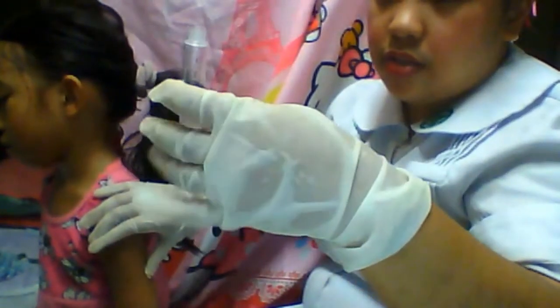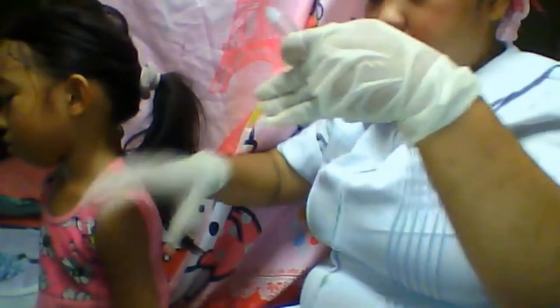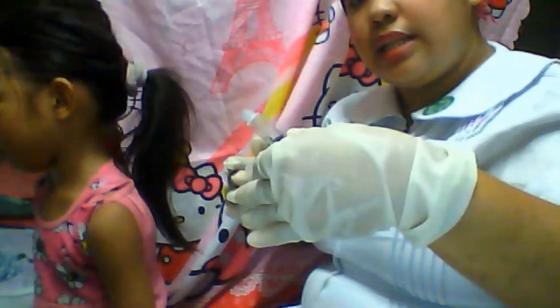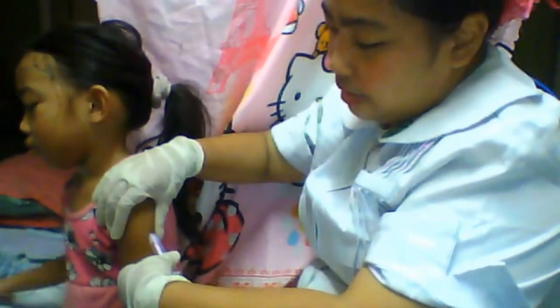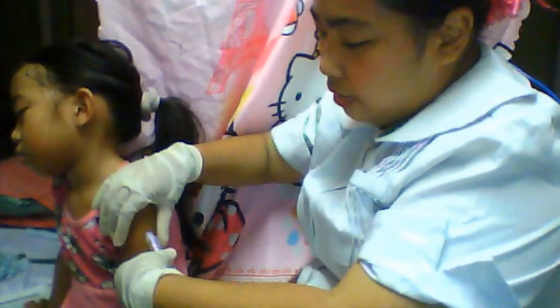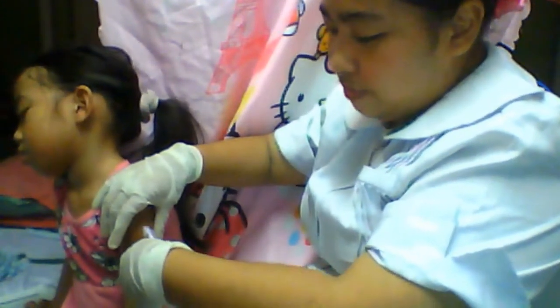So you can do this technique. Okay, like that. This would be touching your patient, and then do it slantly like that. That would actually already be 45 degrees. Okay, so you do it like that. You insert the needle only halfway through, and then you can hold it this way, or you can just use this one.